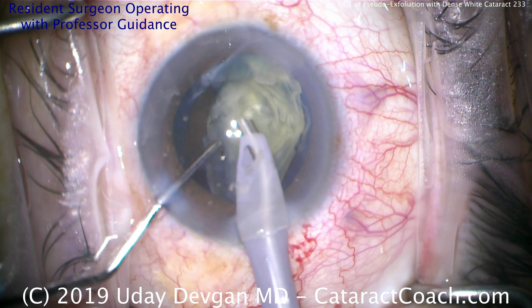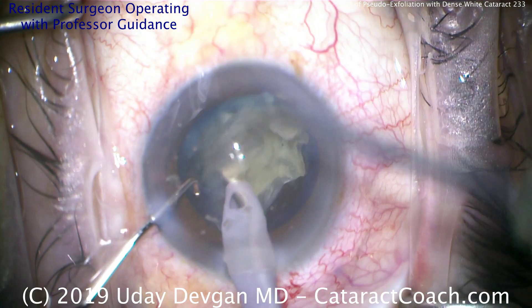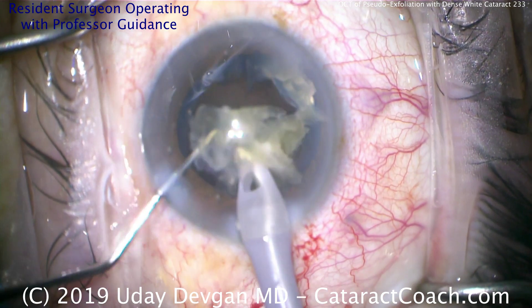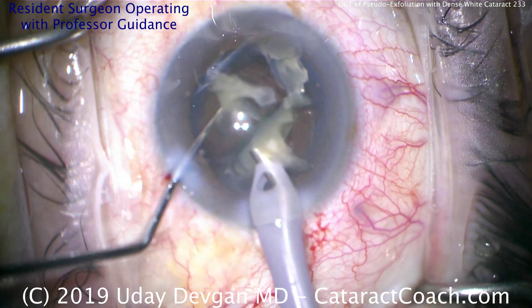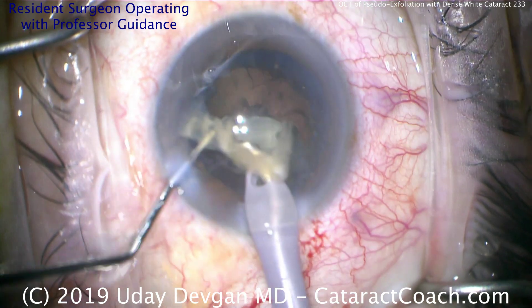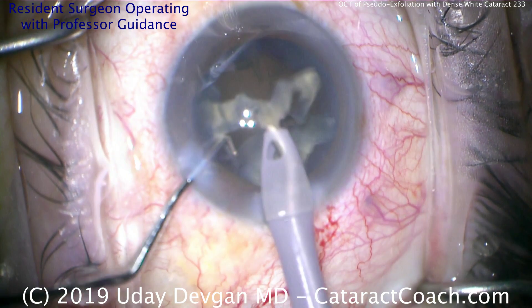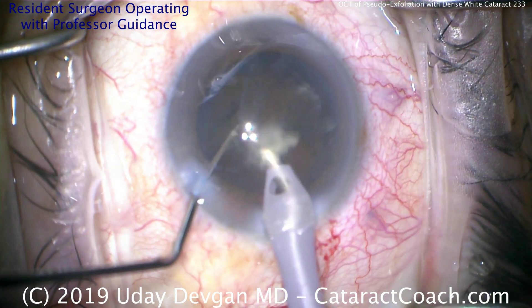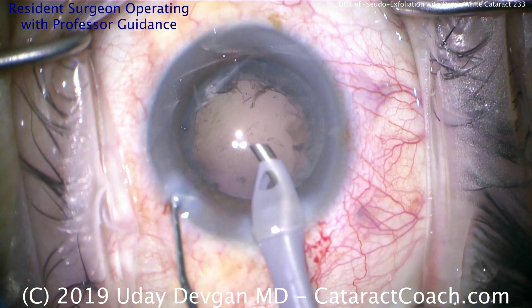The last little bit is left. Look down and you'll see there's no epinuclear shell and very little cortex — so nothing's really weighing down the capsule bag. As we remove the very last piece, let's keep the chopper in the safe position — meaning the smooth backside of the chopper towards the capsule bag to protect it. The capsule bag can flop around under the fluidic conditions because nothing is weighing it down, and we want to avoid anything touching the posterior capsule. Nucleus is out.